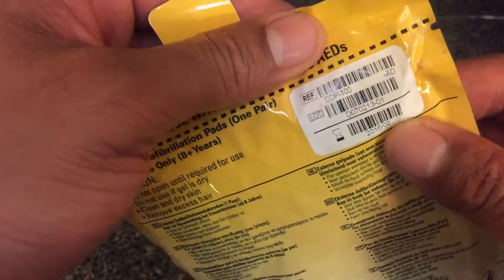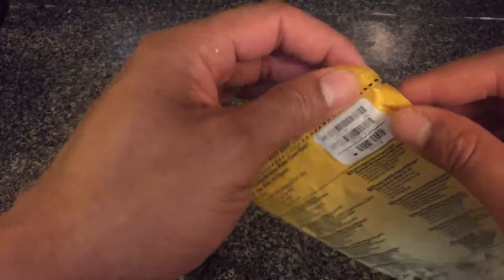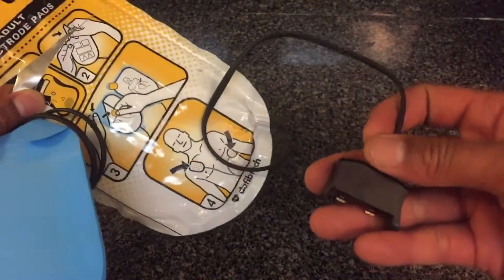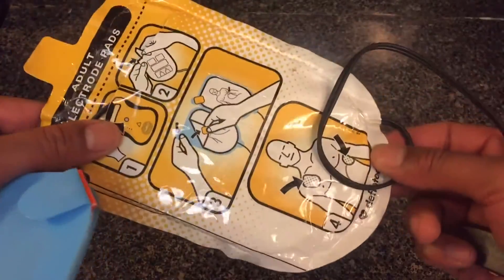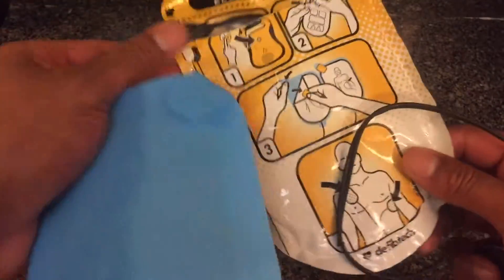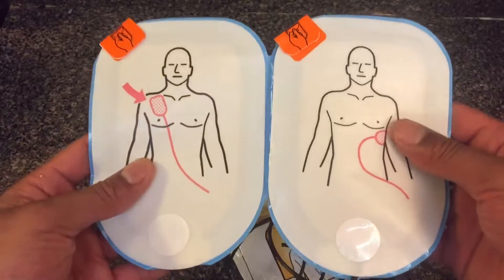It shows the model number up here: DDP-100 — that's the adult electrode pad. Now we're going to open it up. You take it and open it at the top, pull out the pad, and the cable is actually long. This part stays connected to it — the cable comes through there. I think they do this so the person using the device has instructions right in front of them while they are adhering the pad to the victim.